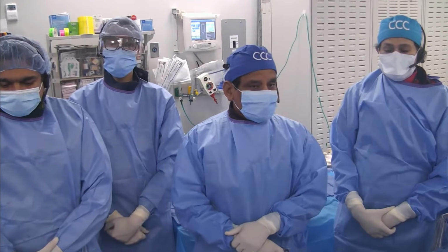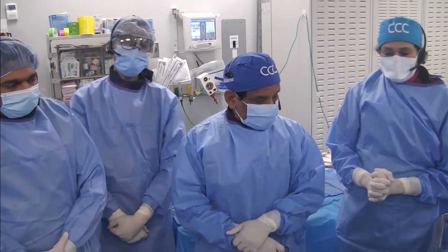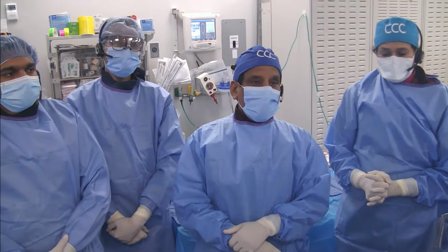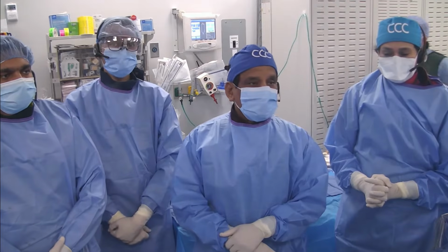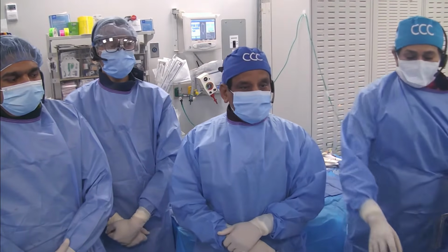CTO is the most important time that we know which wire to be used for what, but even when we have a difficult case, whether it's calcified or bifurcation, it's good to know the wire properties so you know exactly which wire to be used.